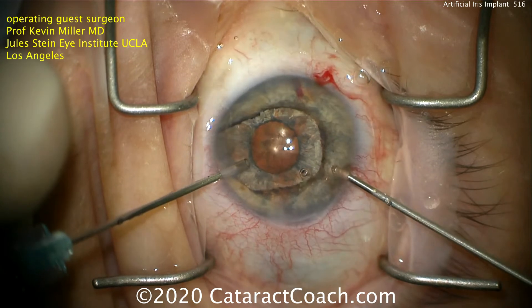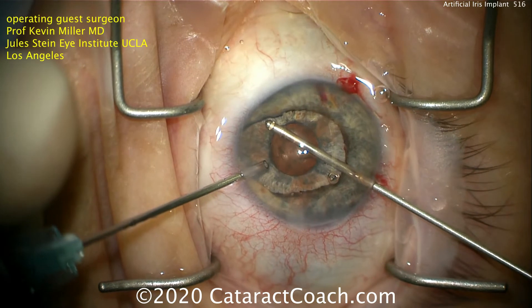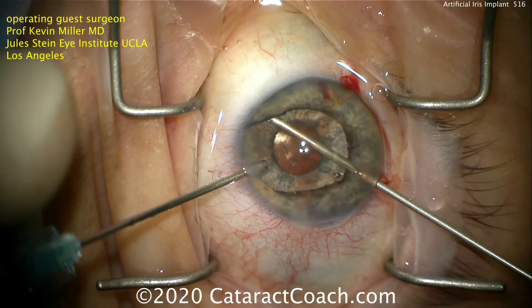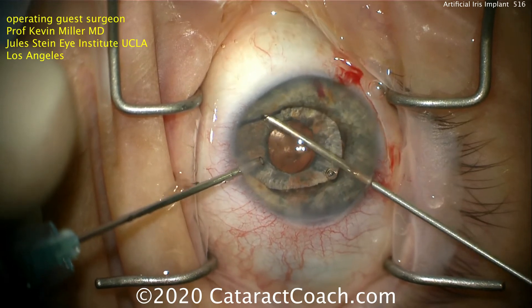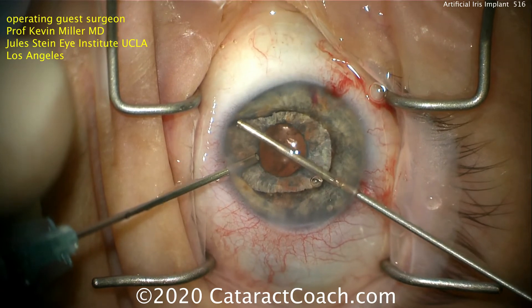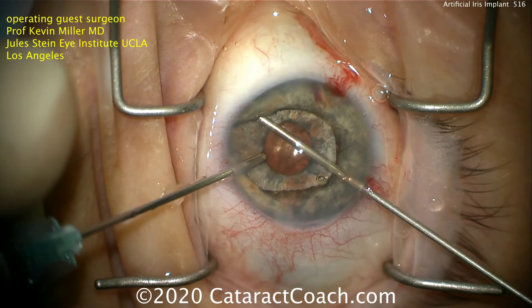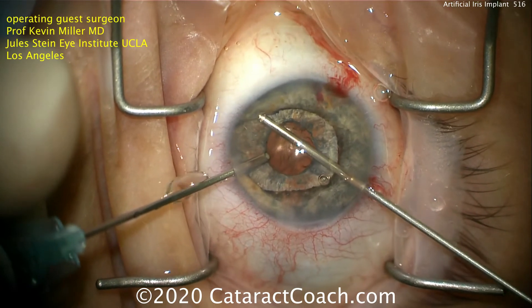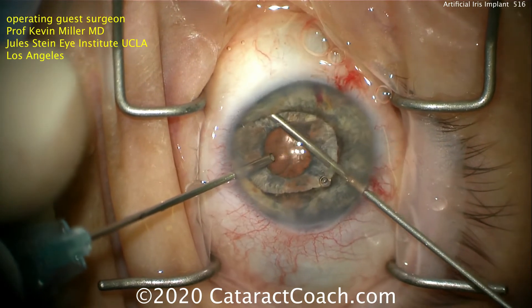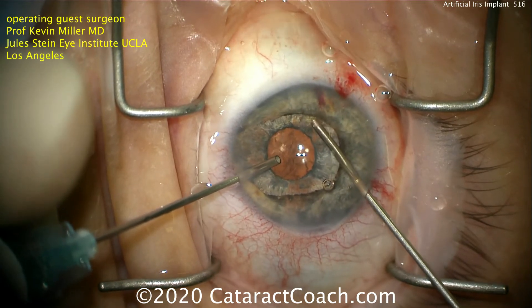The implant is now behind the existing iris. That existing iris has been damaged — it's atrophic, it doesn't work, it doesn't move. And that dark margin is going to cause a cosmetic issue. So this is a technique that Dr. Miller does where he uses a 23-gauge vitrector to very slowly go and trim away that remaining iris tissue, especially any dark pigment at the border, because that dark pigment at the border gives the appearance of not quite a normal eye.